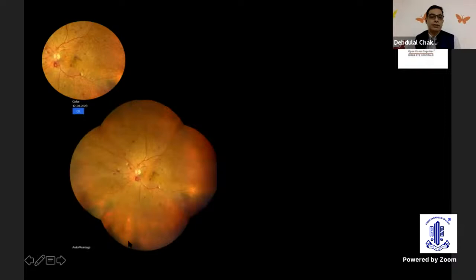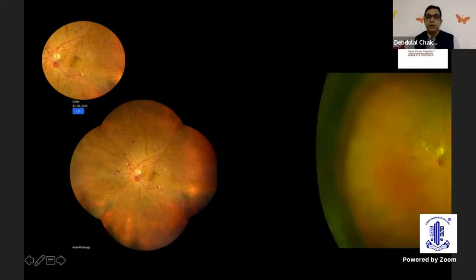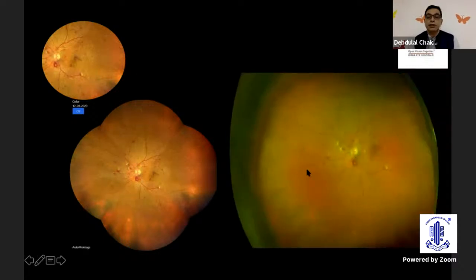We use the Claris, and this is an auto montage with the Claris. This is a wide field auto montage with the Claris, and of course, we have the Optos. All these three images are incidentally from the same patient, and you can just summarize to tell that the images tell it all.